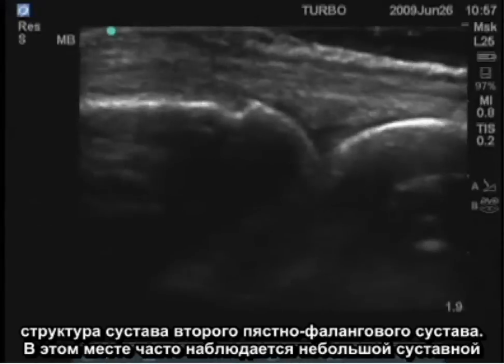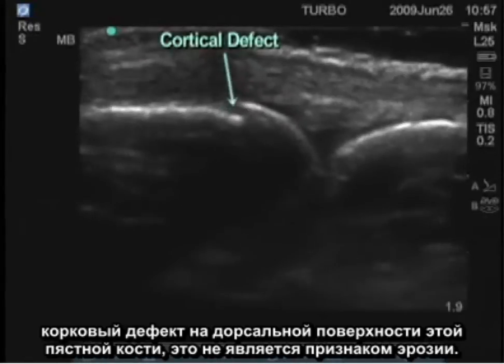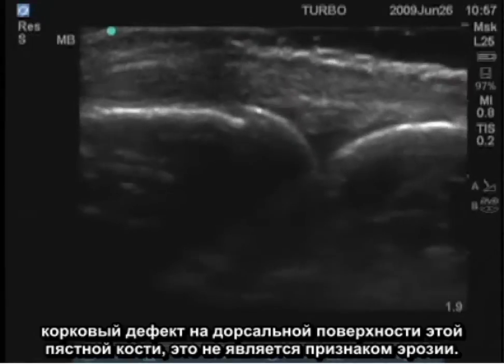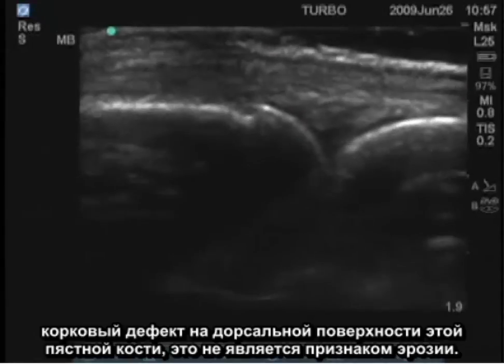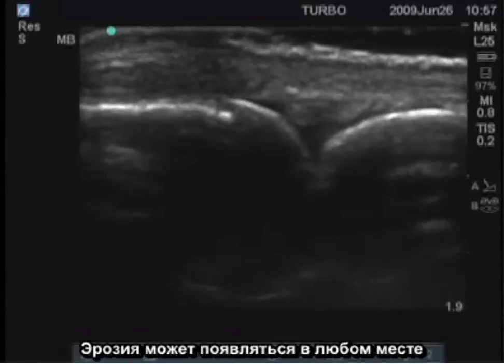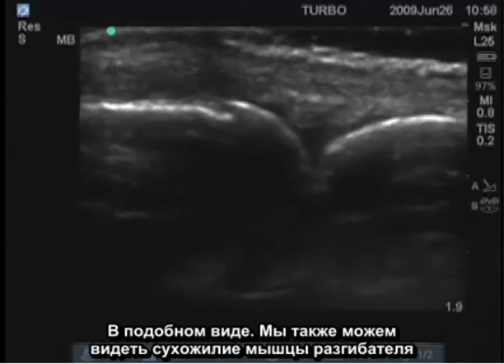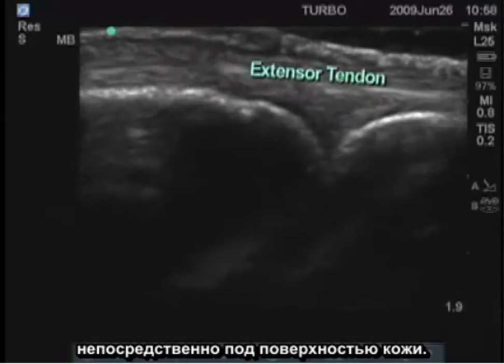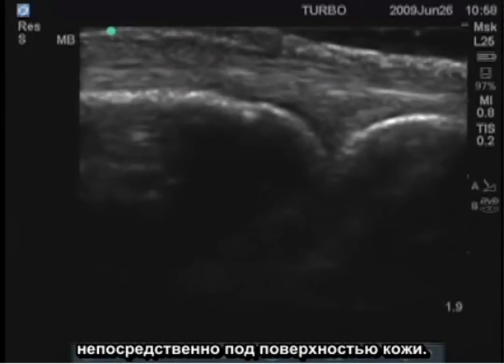There's frequently a small articular cortical defect on the dorsal surface of this metacarpal — that is not an erosion. An erosion would appear elsewhere with this type of appearance. We can also see the extensor tendon superficially, right under the surface of the skin.